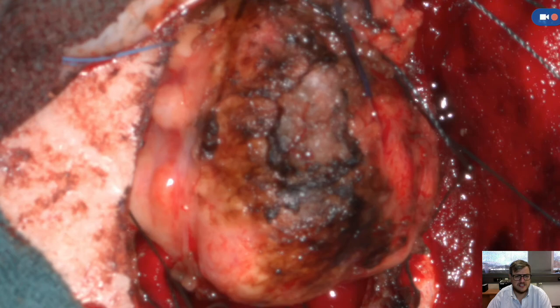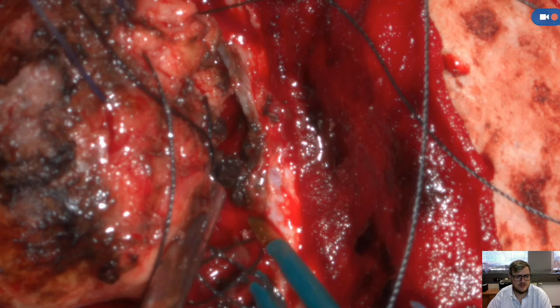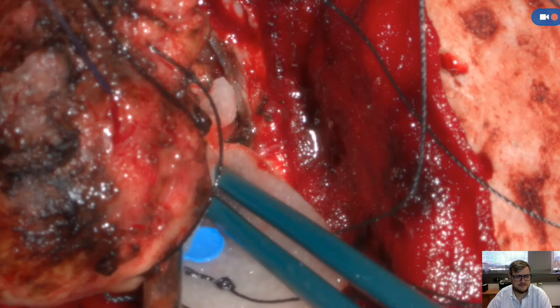Now she repositions the robotic scope to look in all angles in order to be comfortable in resecting the tumor completely. She's very fond of cottonoids — you can see that.